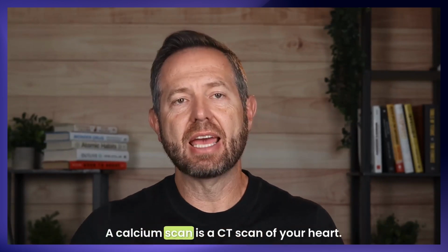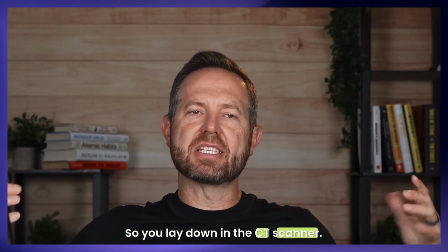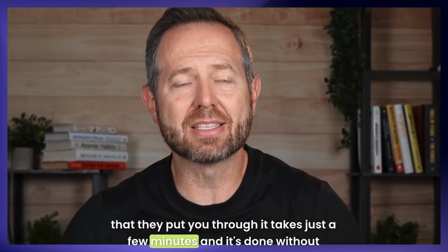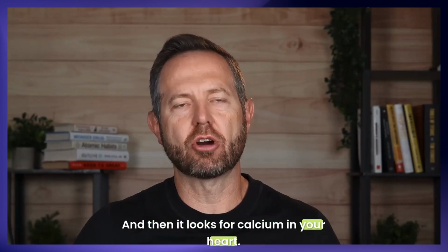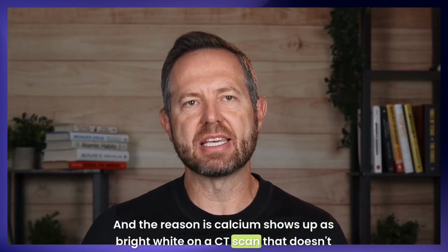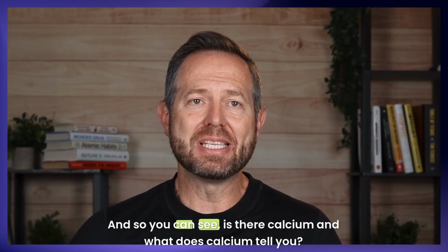A calcium scan is a CT scan of your heart. So you lay down in the CT scanner, it's a big donut. They put you through it, takes just a few minutes, and it's done without contrast, no IV, and then it looks for calcium in your heart. And the reason is calcium shows up as bright white on a CT scan that doesn't have any contrast in it. And so you can see, is there calcium?